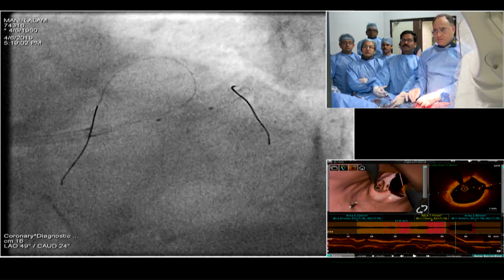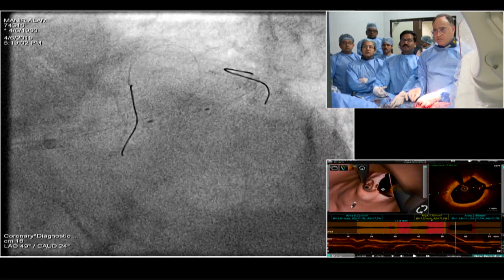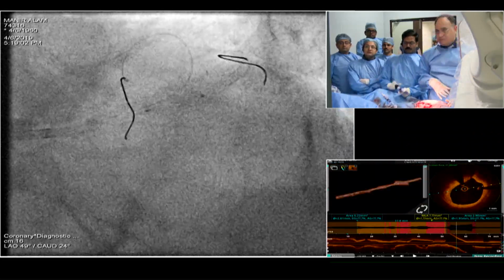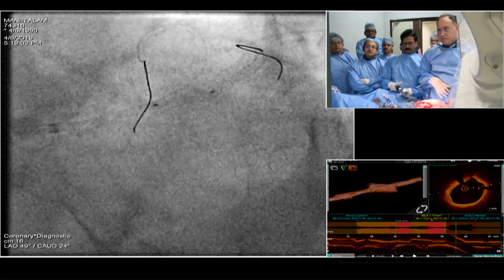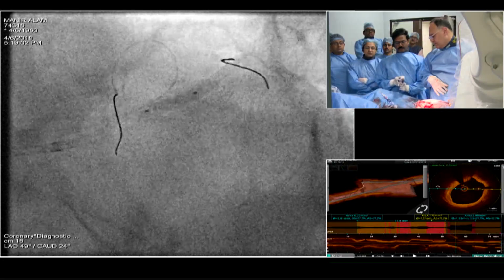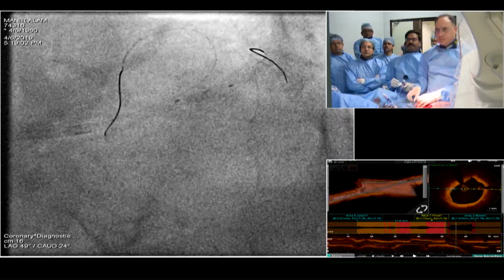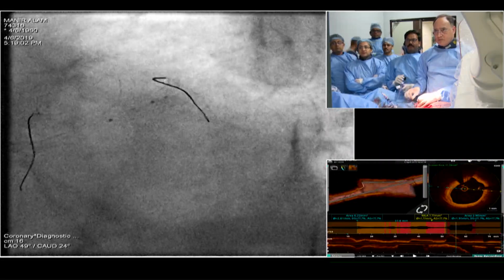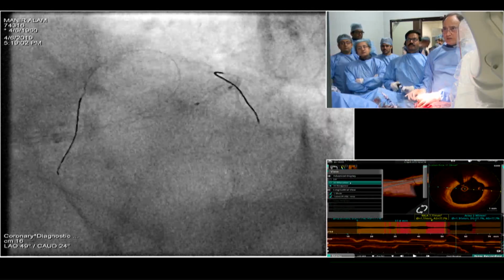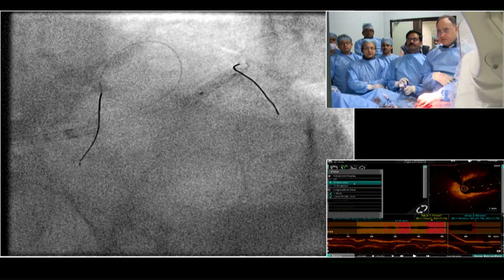No, but these stenoses are not so close enough to do a typical V stent. But even then, if you want to keep some stent struts in the left main, say 1 millimeter, it may not allow the other stent to go. So it is better to have two stents together. 14, 16, 18, 18. You see, it touches the wire of the LAD. No, that's okay. I think in here I would put two stents separately, because then you can concentrate on each stent properly, get it where you want.